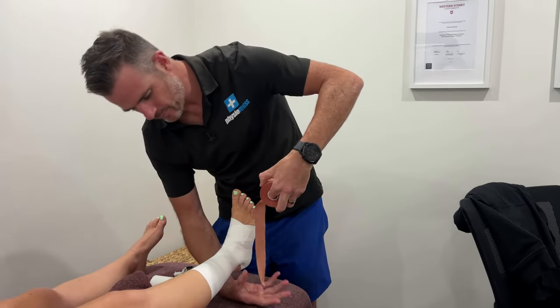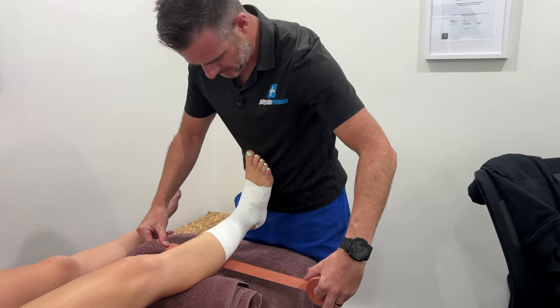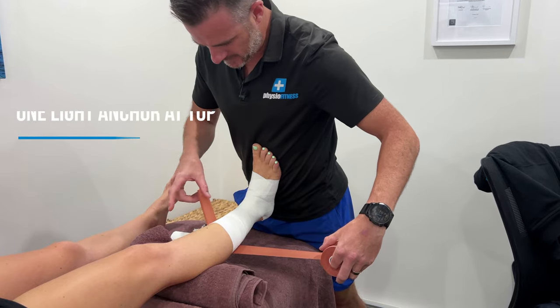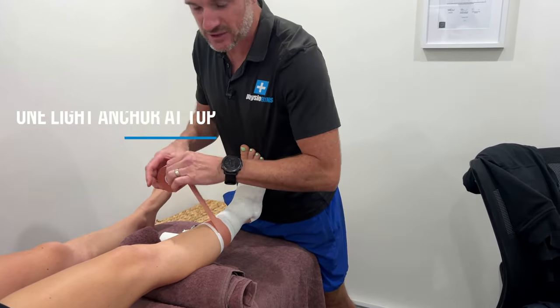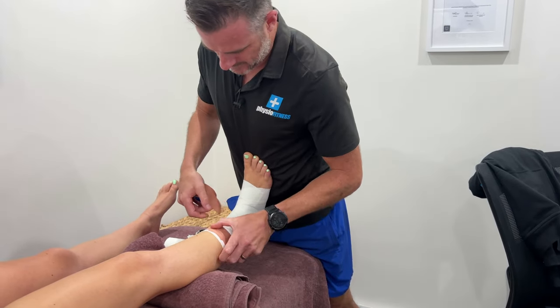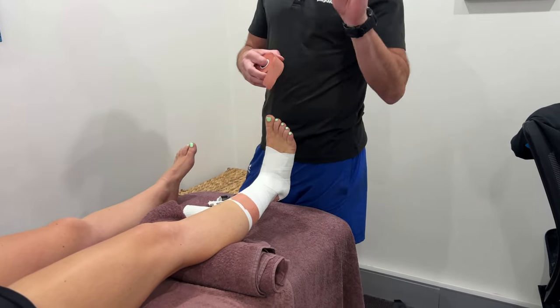To lock that underwrap off at the top, put an anchor of rigid tape. Sometimes I like keeping that foot in dorsiflexion while I do this. The anchor is going to go up on a little bit of an angle due to the shape of the shin. Once you've got your anchor, you're going to do two stirrups.